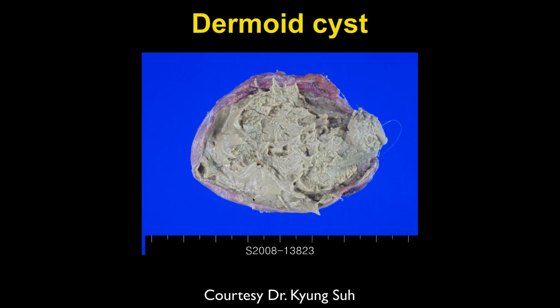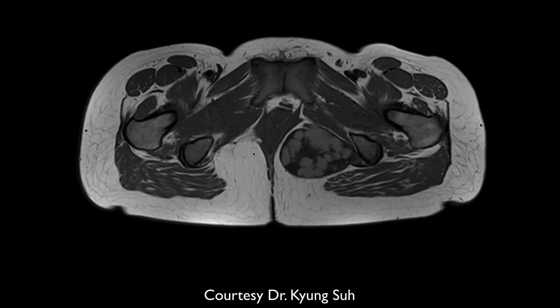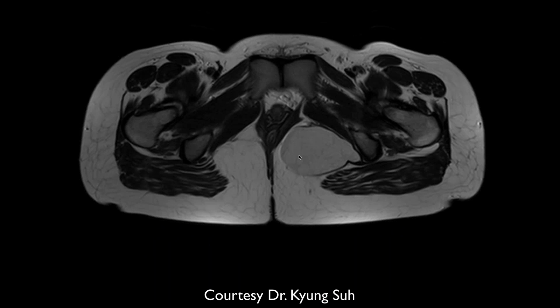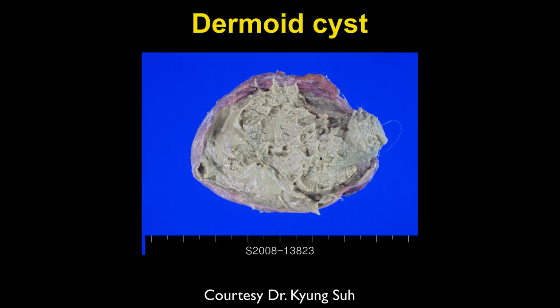It's kind of an oily structure, and if you go back here on some of these, it really doesn't look like lipid tissue. Mm-hmm. On the T2 weighted axial images, though it certainly is bright on the T1. So it has something that is relatively short T1, but it also has short T2 signal in it. So it's really more of kind of an oily structure inside of it, which gives it this very unusual characteristic, which is characteristic of a dermoid cyst.